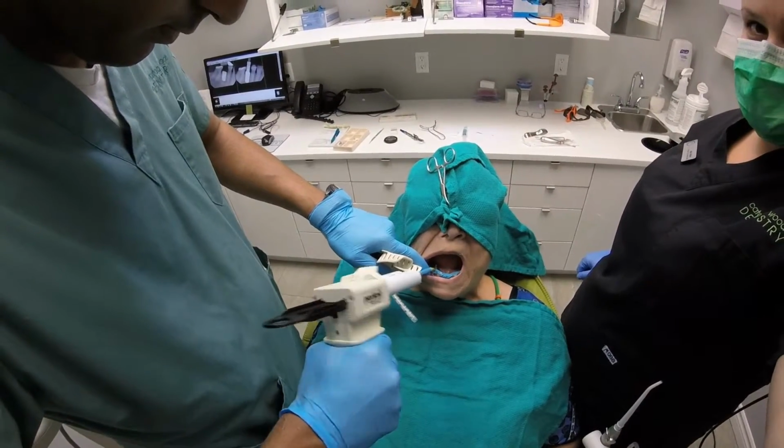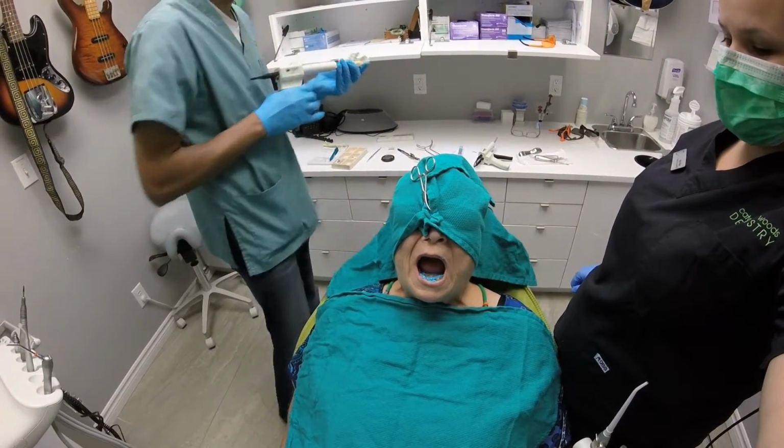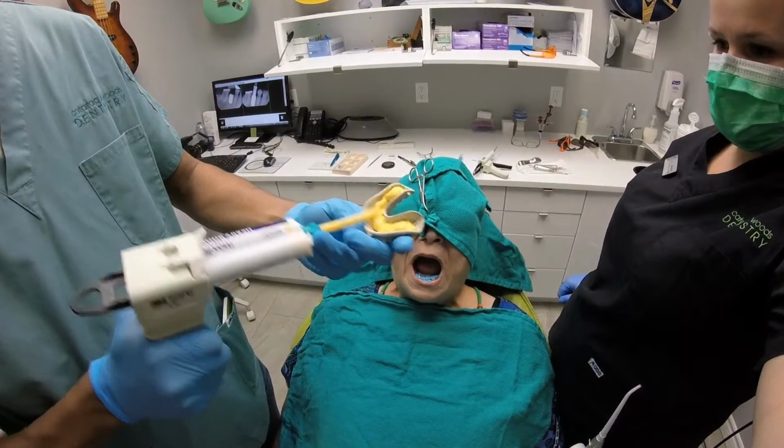I'm just squirting some light body in there, and now I'm squirting some heavy body in there. And this is a product by Maxil. It's a heavy body fast set impression material. This is probably one of the fastest impression materials I've ever seen. I like using light body and heavy body.